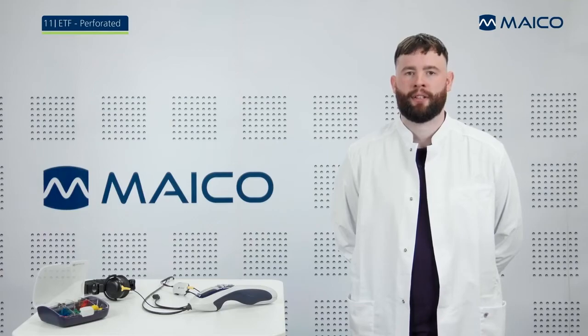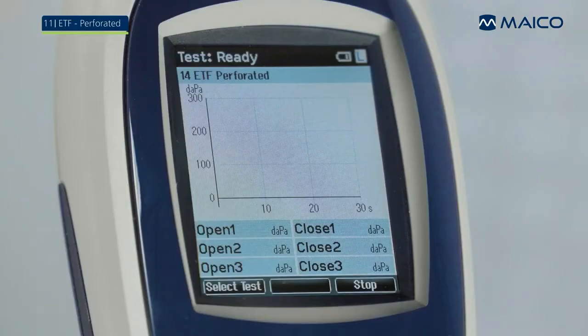ETF perforated determines if the patient can open the eustachian tube when the tympanic membrane is perforated or an open PE tube is in place. ETF perforated will put the middle ear under start pressure of 300 decapascal and will hold the pressure for 30 seconds. The graph displays the vertical axis as pressure and the horizontal axis as time.